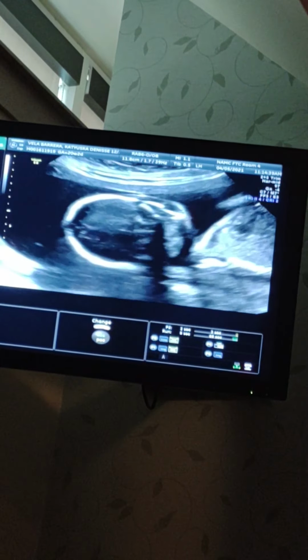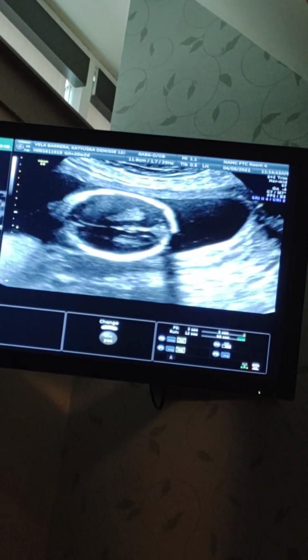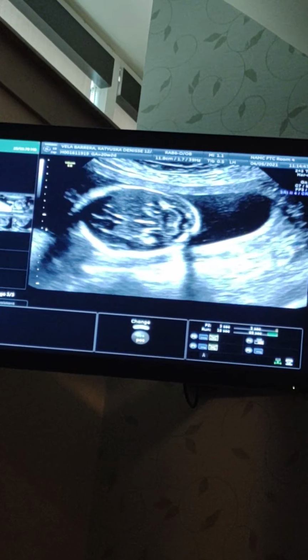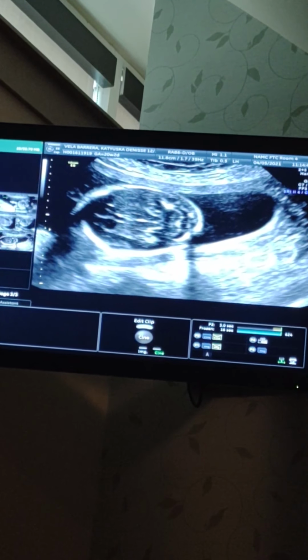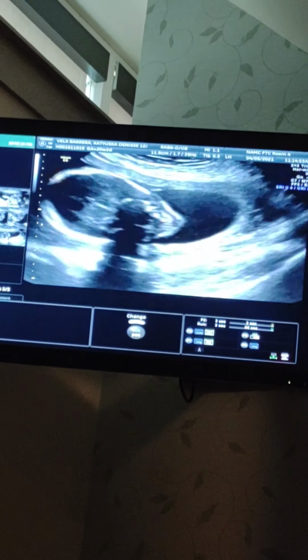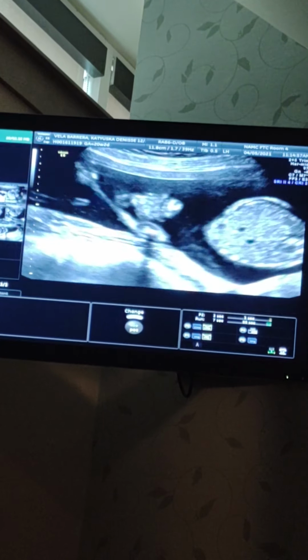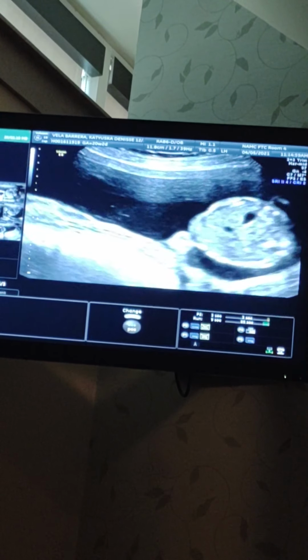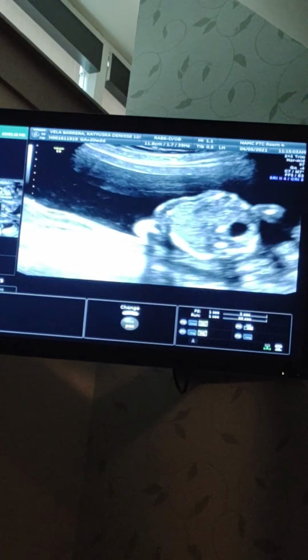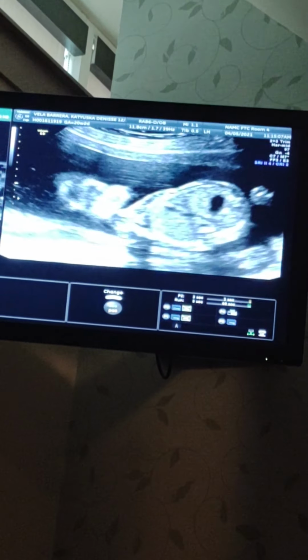Brain while you were talking, everything looked perfect there. This is looking inside at the brain, choroid plexus, the cerebellum, all looking normal. All the structures are present and accounted for. In front here, you're seeing a little bit of the front of the face. You can see the soft tissue of the nose and the lip go by there. That's the top of the head. Well, that's the front of the face. Right there, yeah.